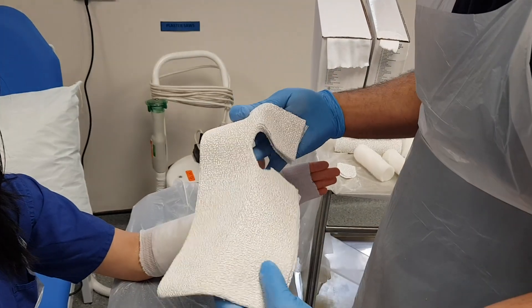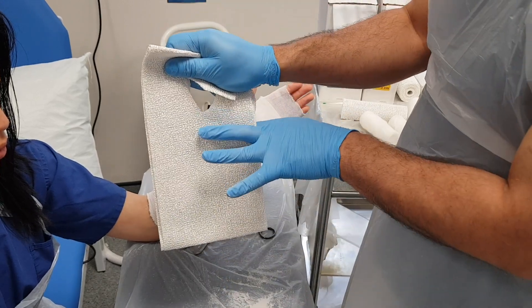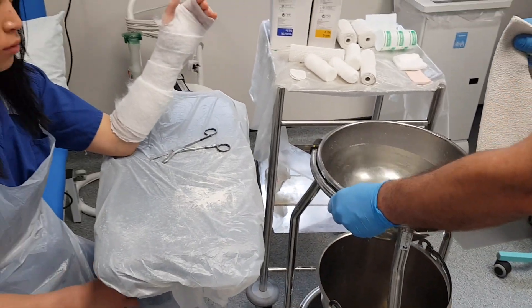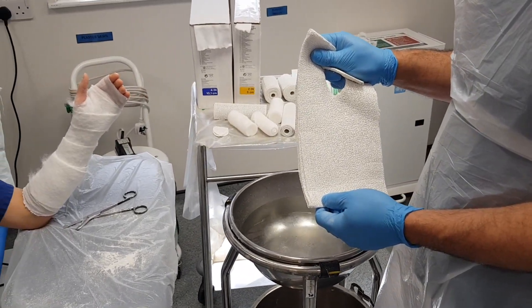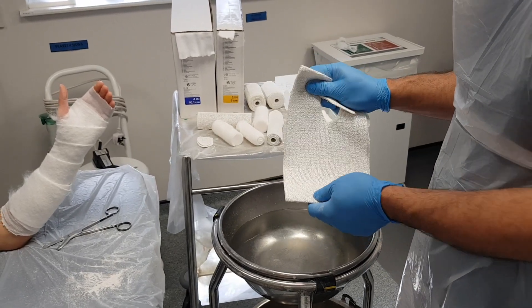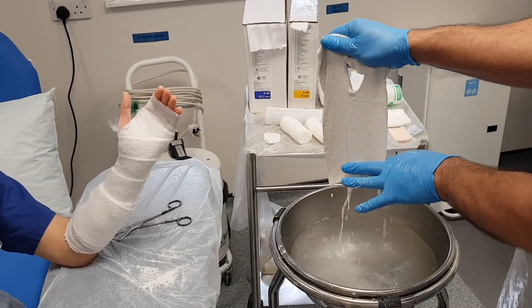I'm going to dip this in water, holding it so it doesn't come apart. Dip it until it's completely soaking, then squeeze out the excess water, which will also bring the six separate layers into one solid laminate. The water temperature is important — you want ideally about room temperature so that the plaster doesn't set too quickly, and also because there is an exothermic reaction when it gets wet, and you don't want to heat up the skin too much and cause a burn. Dip it until the bubbles stop, then take it out and squeeze out the excess fluid.